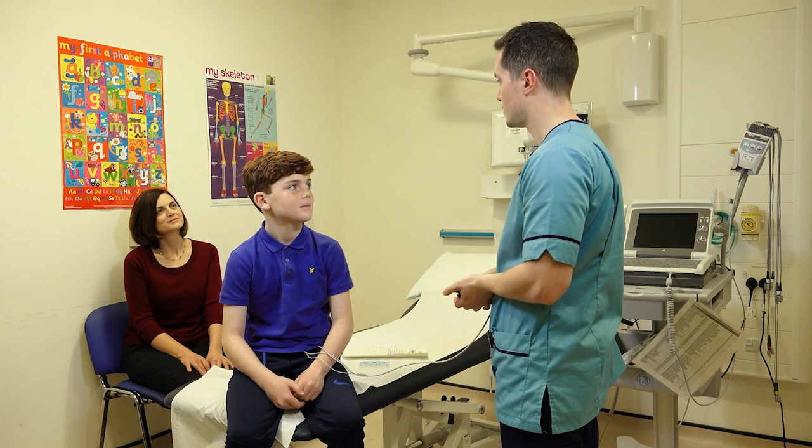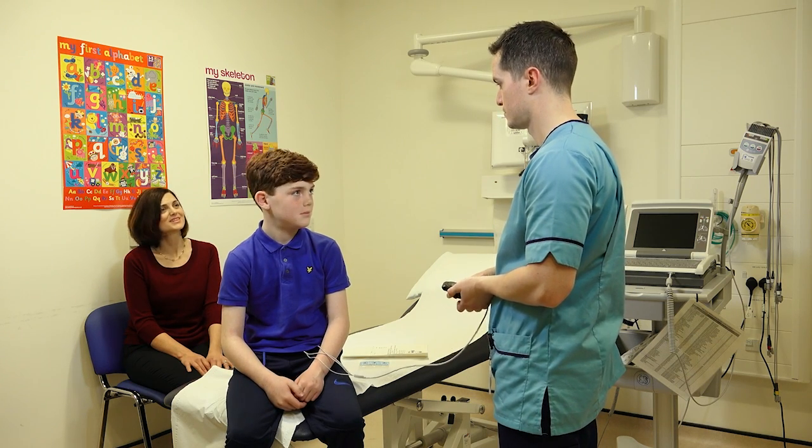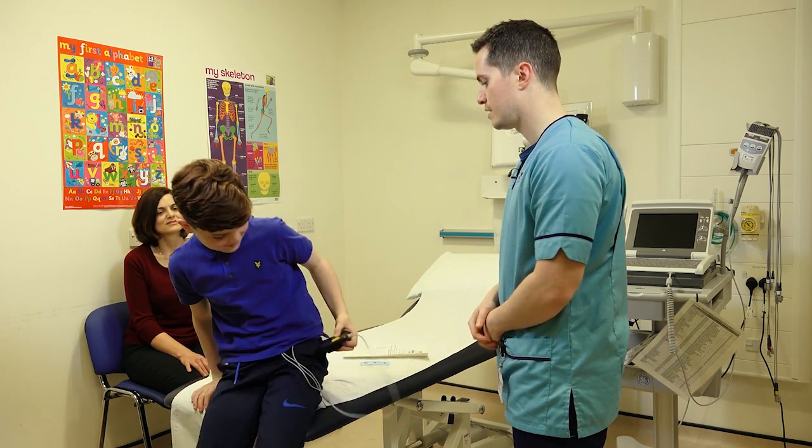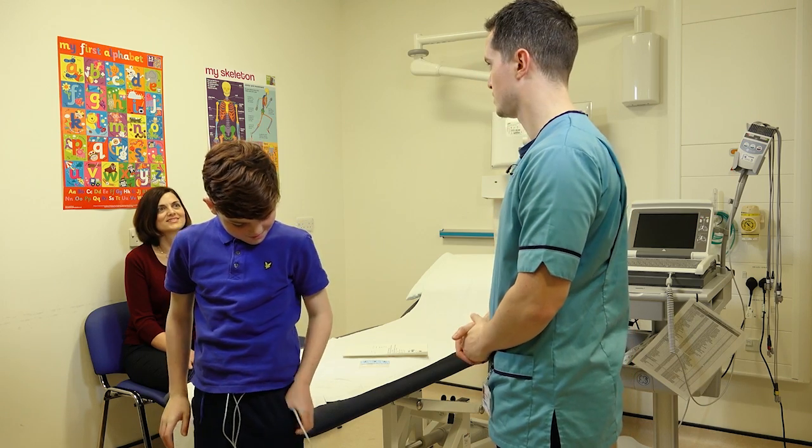Is there anything else you guys need to know before you leave with the monitor? No. Okay, that's you guys all done then. I'll give you the monitor — you could probably put that in your pocket. You're free to go and I will see you this time tomorrow.